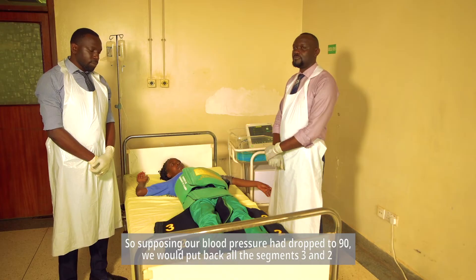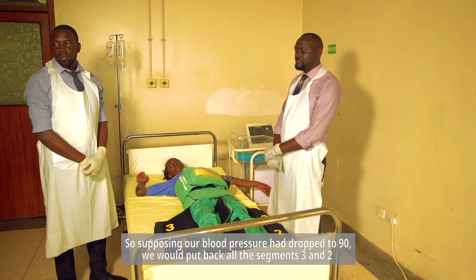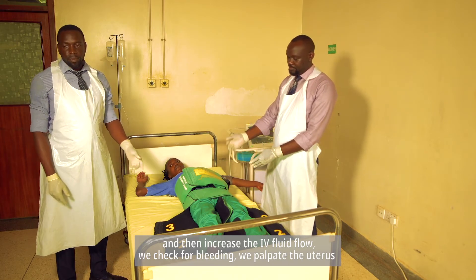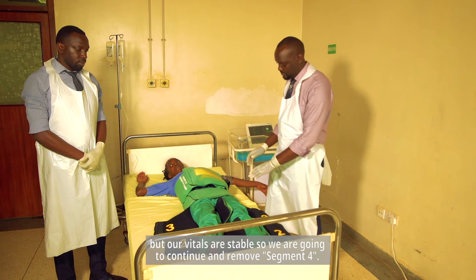If our blood pressure had dropped to 90, we would put back segments three and two and then increase the IV fluid flow. We check for bleeding and palpate the uterus, but our vitals are stable, so we are going to continue and remove.